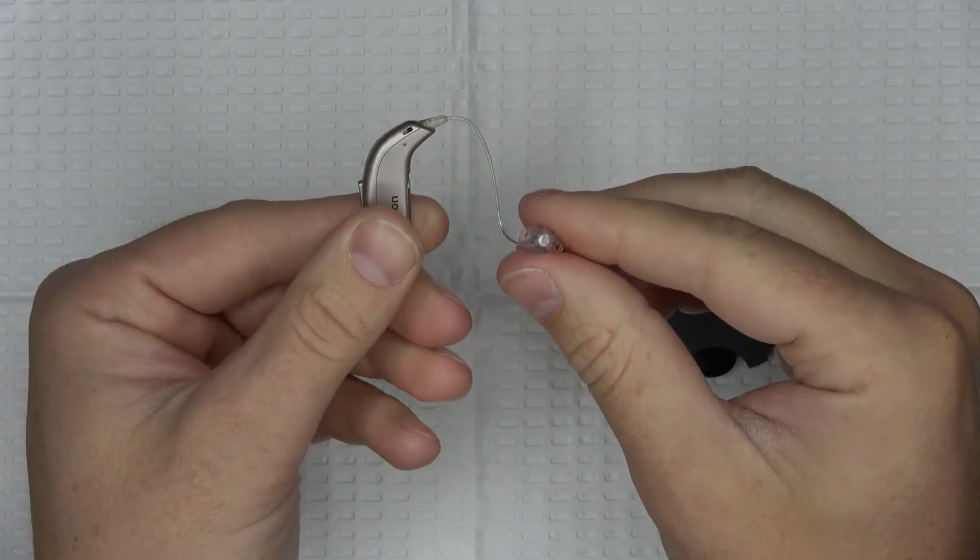And that is it. Depending on how much earwax you produce, it's not a bad idea to change these wax guards at least once a month, or sooner if you think your hearing aids are weak or just not amplifying the way that they used to.